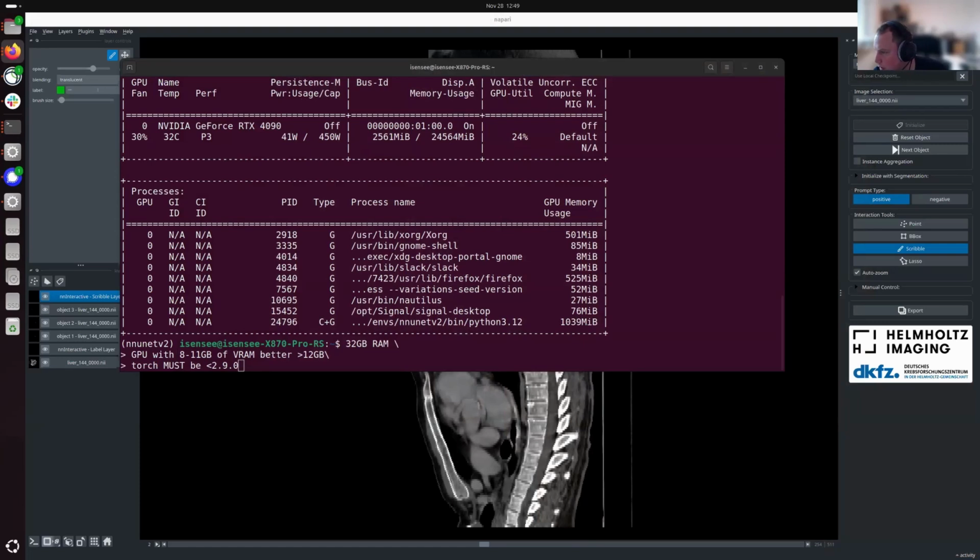Awesome. We have one more question by Sheng Yang. Great talk, fan of nnUNet. Just want to know more related to nnInteractive. When generating pseudo labels using supervoxels, nnInteractive relied on high confidence masks produced by SAM. However, because these high confidence regions are usually the ones the model already performs well on, continued training on them may provide limited new information. Could this potentially lead to diminished performance?